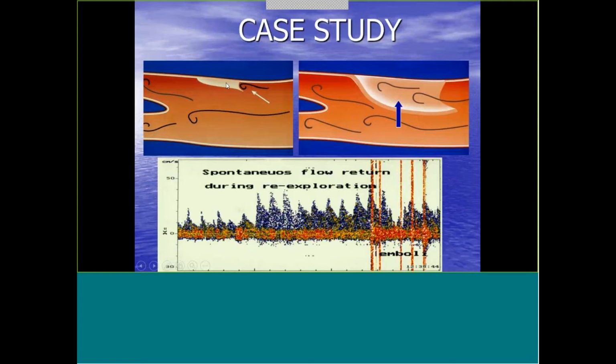This wasn't identified in this case, and as flow kept flowing and getting all of this blood pulled, this vessel lumen down and caused what I was seeing here. So it was like this was literally flapping. And if you think about a flap, so we've got this will come back up, and then as the blood flows through here, it'll come back down, and then it'll go back up and then come back down. So that's a flap dissection. That's what it means. And this thing will literally go down and occlude the vessel.